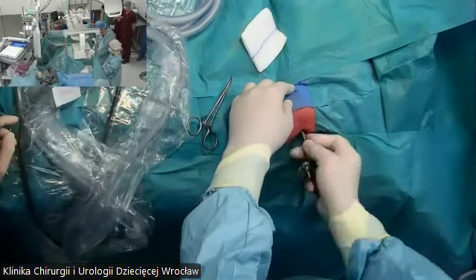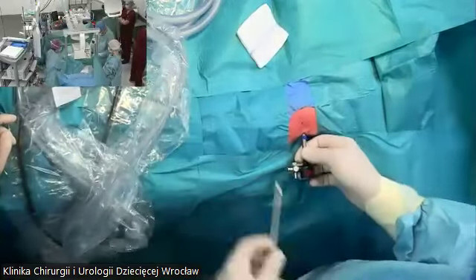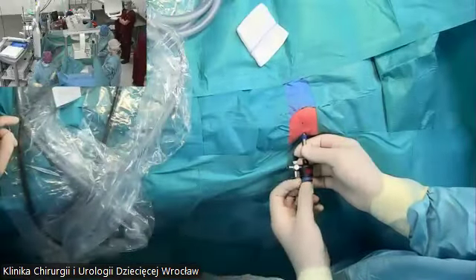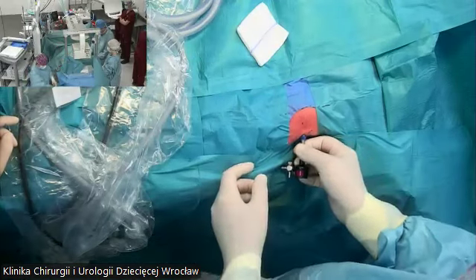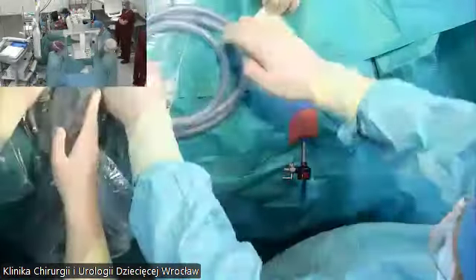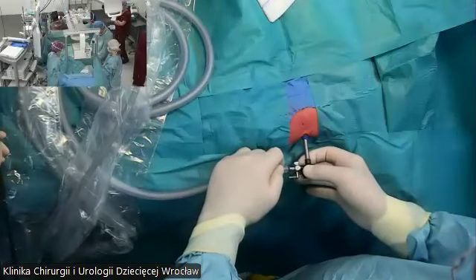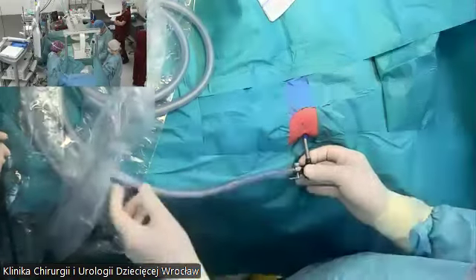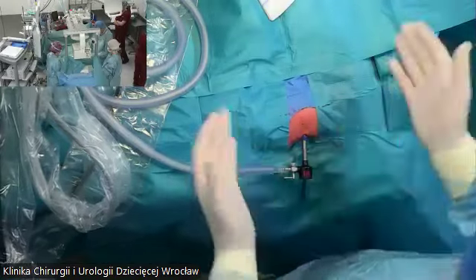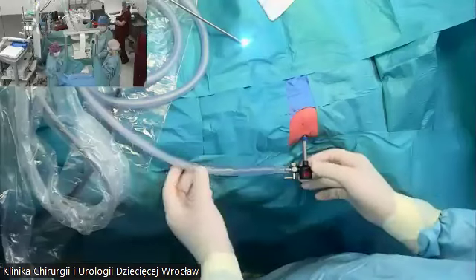We know this is a very small baby, so we are very gentle. Okay, so we are already inside. We will change the rubber to a smaller one because we are using a short scope, 4 millimeter. Let's start with insufflation. The insufflation pressure is 6 millimeters and 1.5 liters of flow. That's very important, especially for such a baby, to have a heater, because if you have a lot of gas losses, it's better to heat it just to protect the baby.